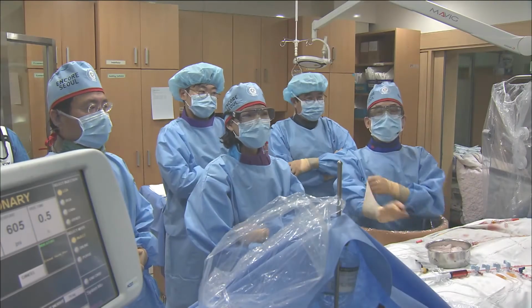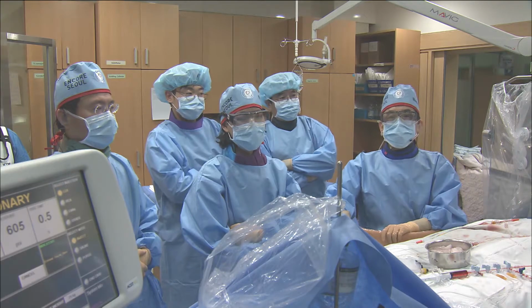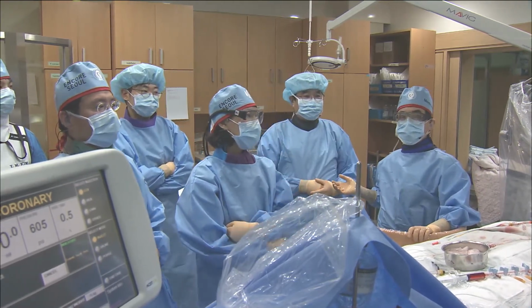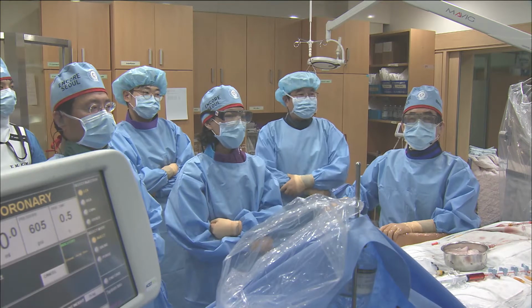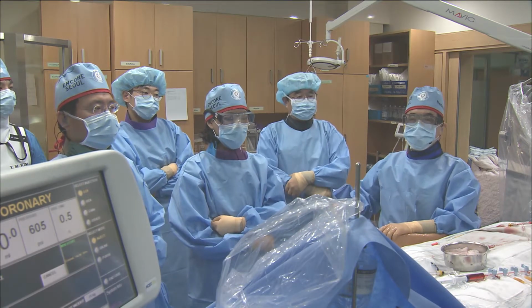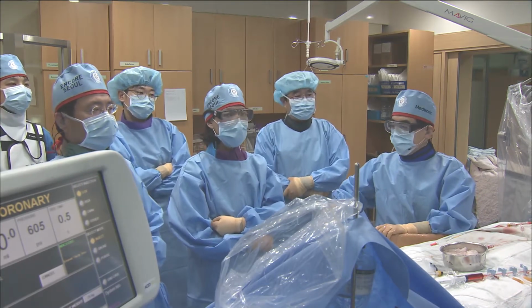Morning. Once again, a live demonstration from Seoul National University Hospital. I'm Hyo-Soo Kim. My guest is Dr. Asakura from Japan. He's really an excellent person for CTO intervention. So I'd like to be guided by him to perform CTO intervention for this case.